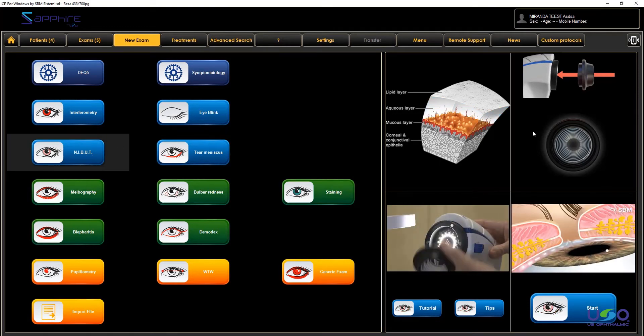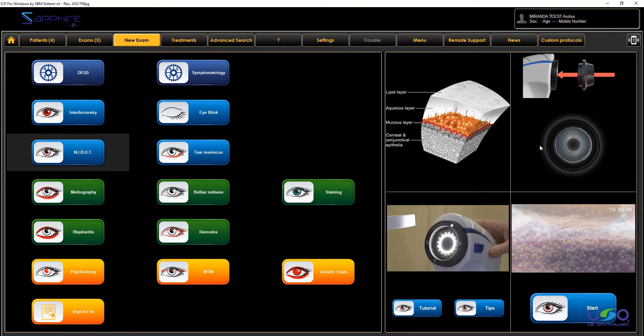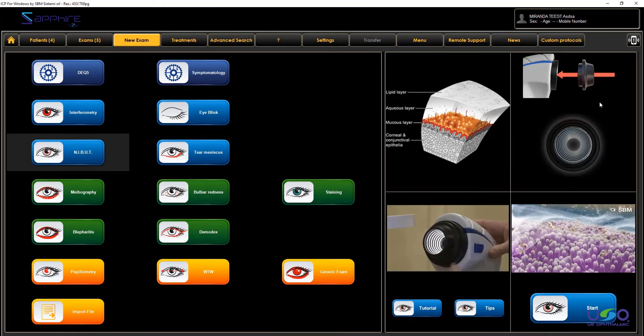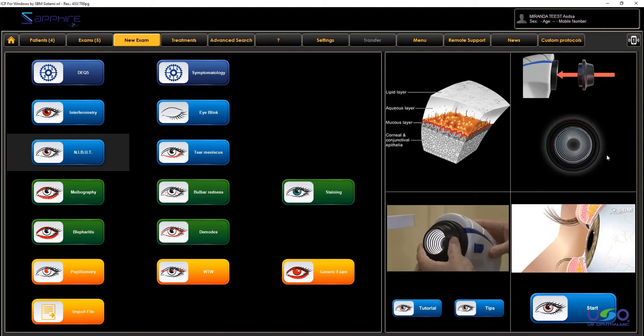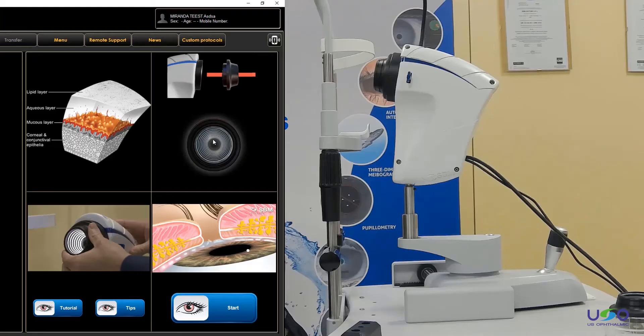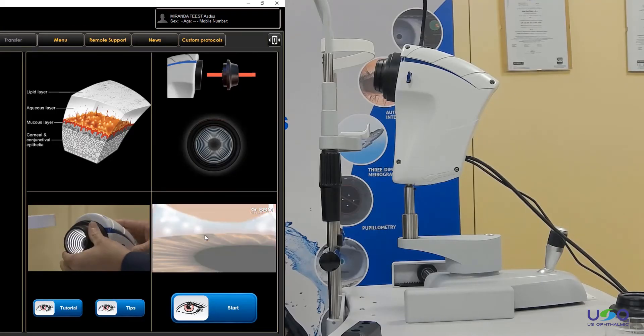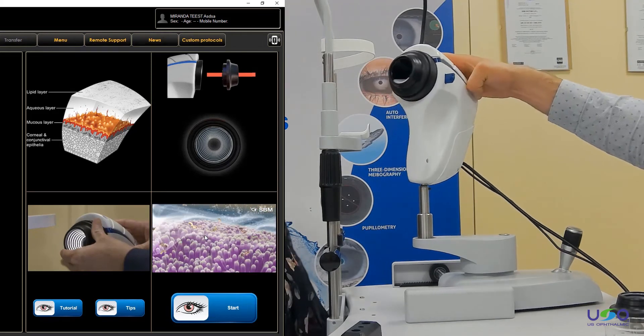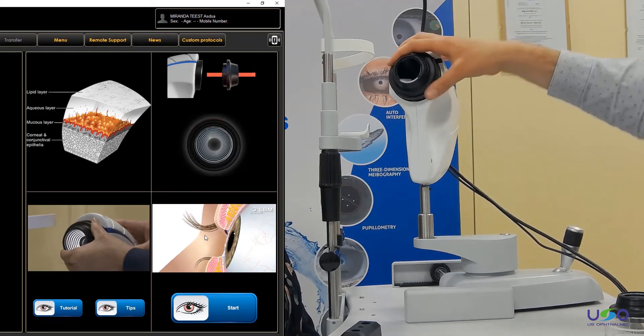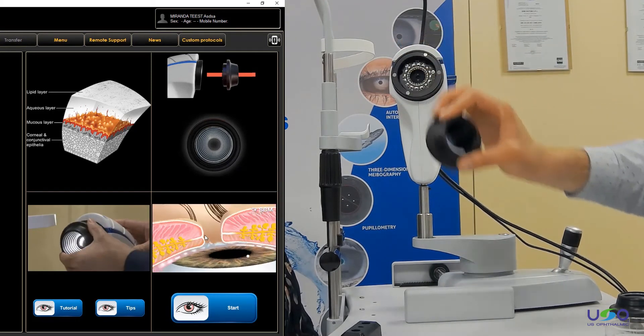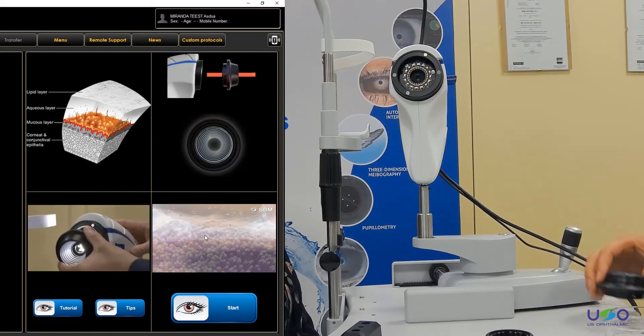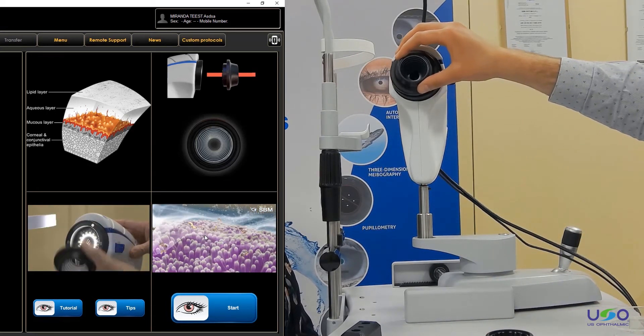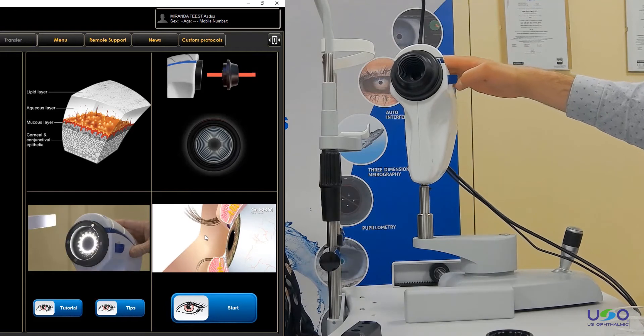To start the evaluation, before to start, I want to remember that you should set inside the right cone. So in this case, the right cone is the placido ring cone, and I will show you how to set it up. It's very easy, so we can remove the cone of the interferometry and we can set up the placido ring cone.